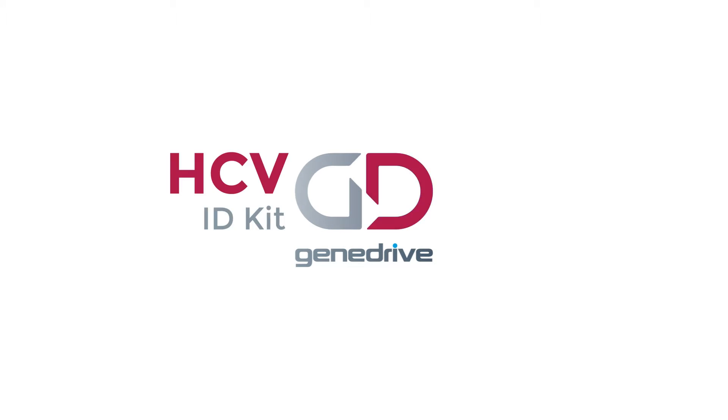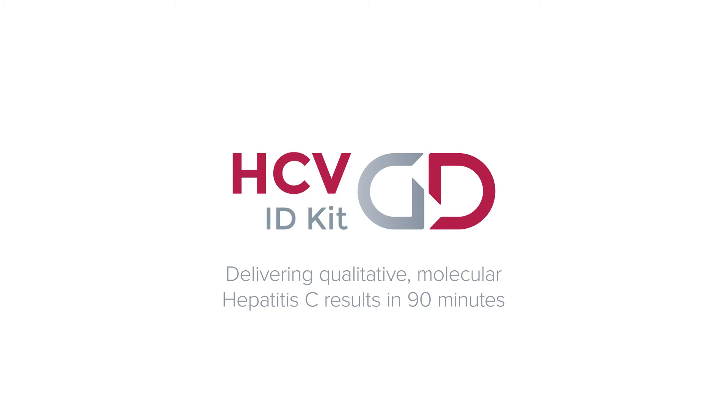GeneDrive HCV ID Kit, delivering qualitative molecular hepatitis C results in 90 minutes.